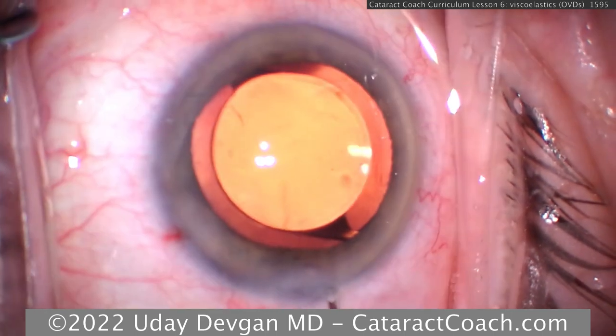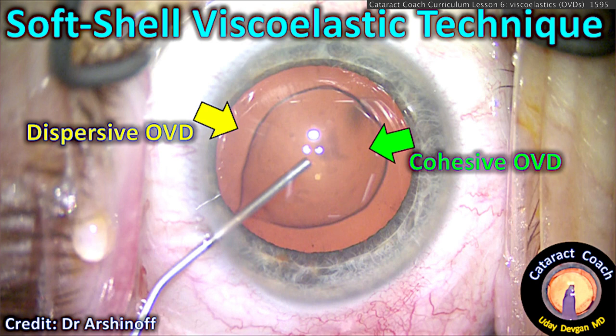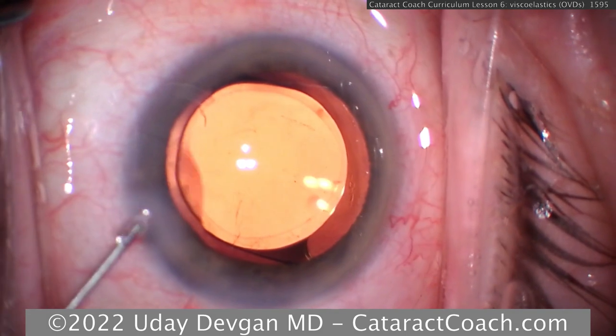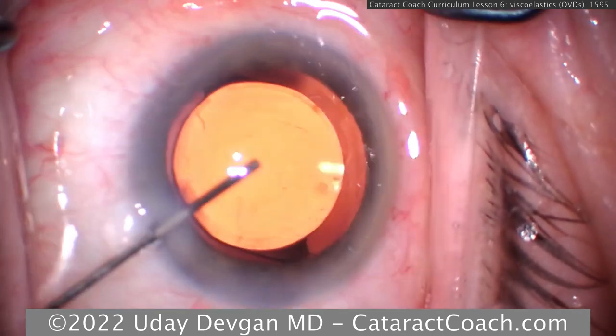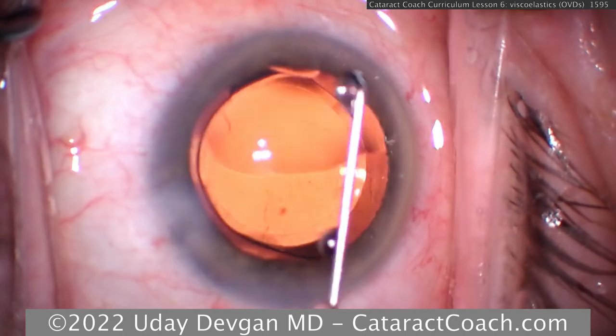Remember, at the end of surgery it is important to thoroughly remove viscoelastic from the eye, otherwise it can block the trabecular meshwork and you can experience a high IOP in your patient. The dispersives can be a little hard to remove because they have a tendency to spread out and coat structures. Cohesives tend to stick together as a single mass and are usually easier to fully remove. Use of a viscoelastic can make phaco easier for the surgeon and safer for the patient. It's for this reason they've become an integral part of our surgeries.